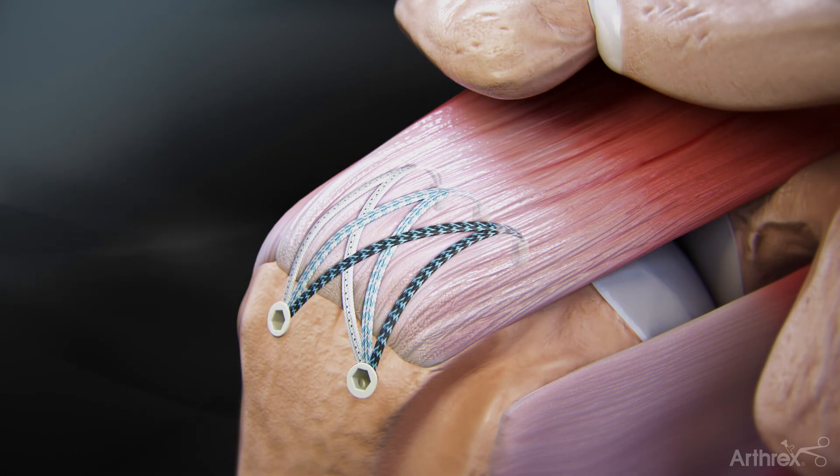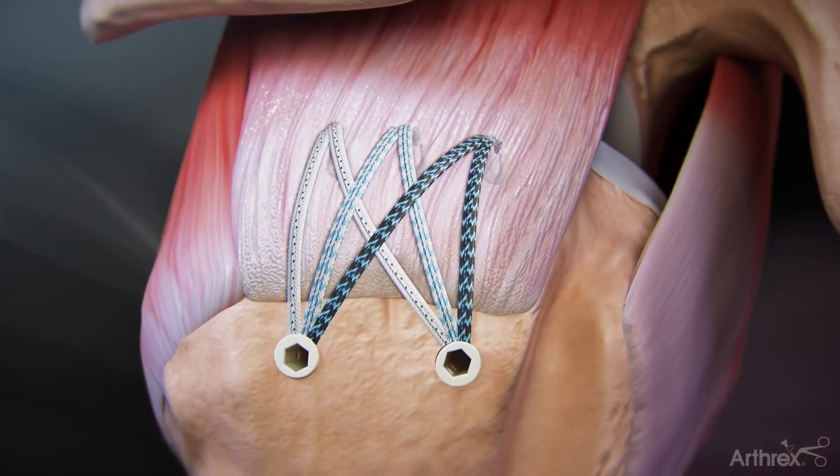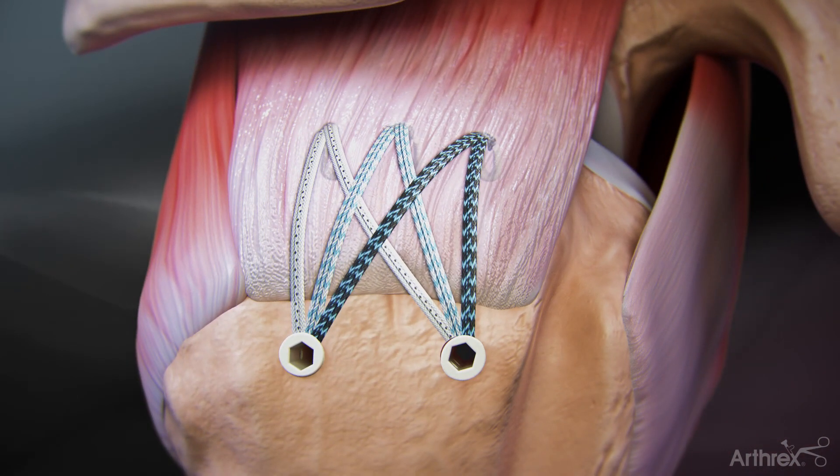Repeat these steps for the second lateral row anchor. This completes the FibreTape Speed Bridge, which enhances footprint to bone contact, providing improved rotator cuff footprint contact compared to traditional techniques.